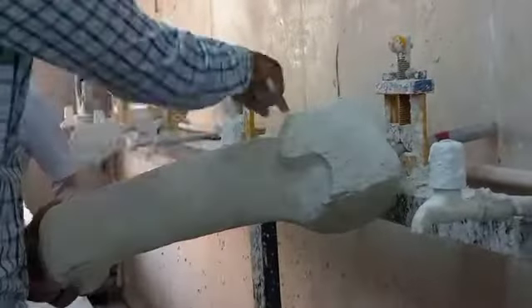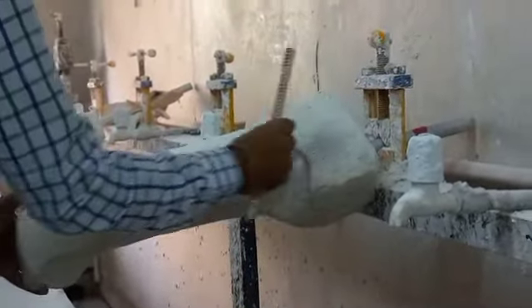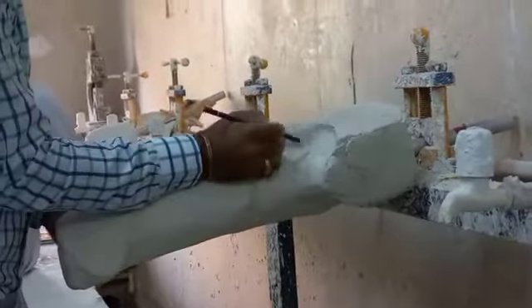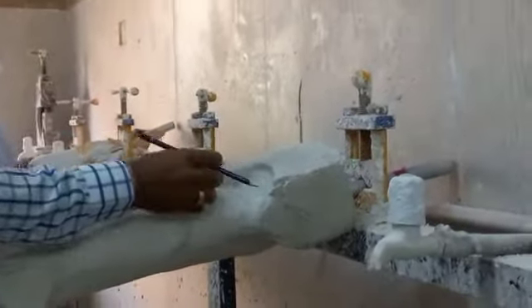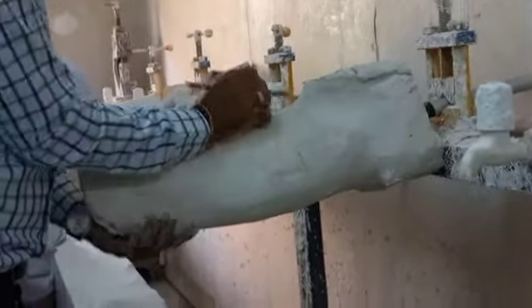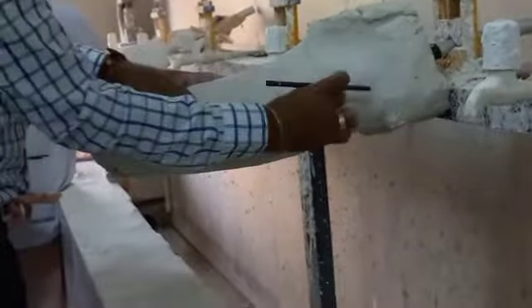And then finally, important is to have the brim position, how it will be. Let's just discuss this thing. So our lowest point, whatever our lowest point was, I have added material so that I am showing, let's say, this was the lowest point. Because from the lowest point, we know this is 4 centimeter. The first measurement was 4 centimeter down, right?